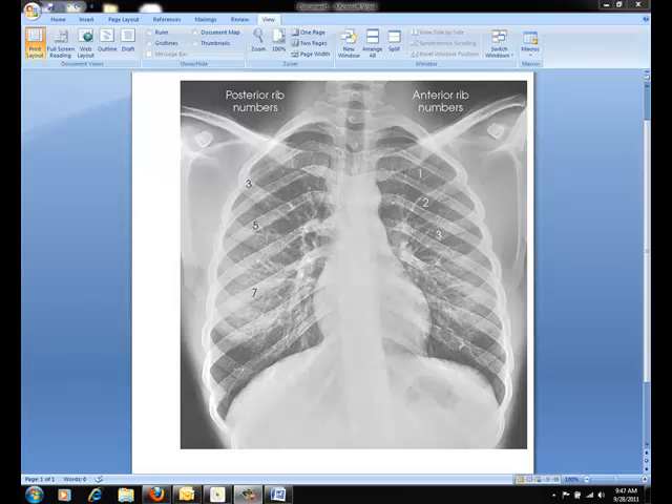Typically an x-ray of the ribs below the diaphragm is also performed on the affected side. For this, you typically will use a 10x12 cassette placed landscape. Never have the inferior border of the cassette any lower than the iliac crest, because the ribs will never go that far — so that's a really good indicator of your centering. Shield the gonads and instruct the patient to expire their breath, getting a second expiration, which will elevate the diaphragm as high as possible.